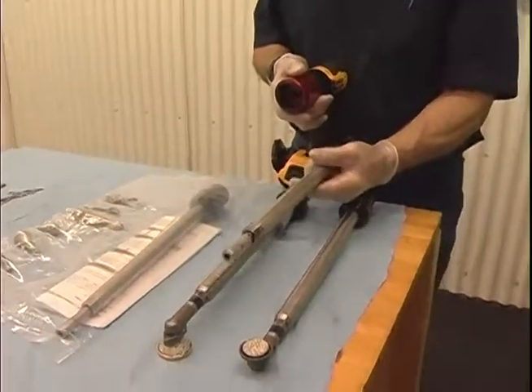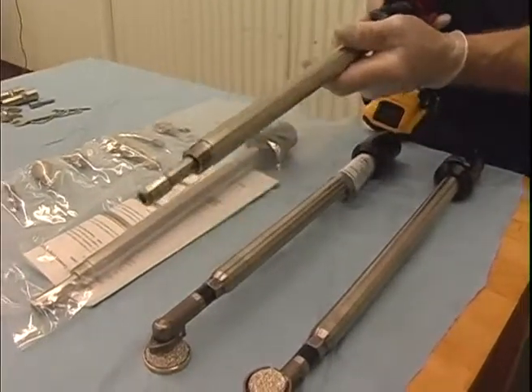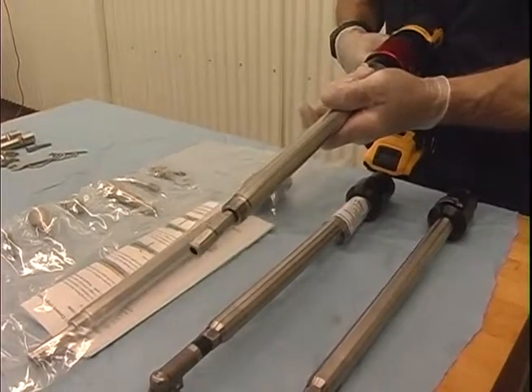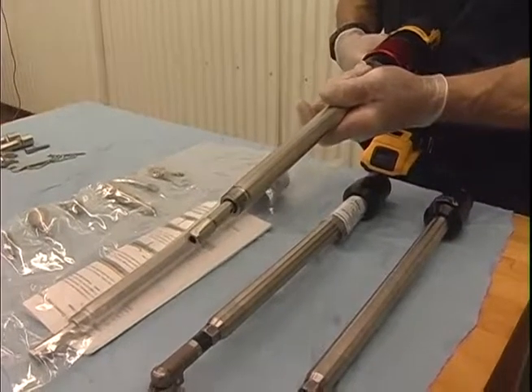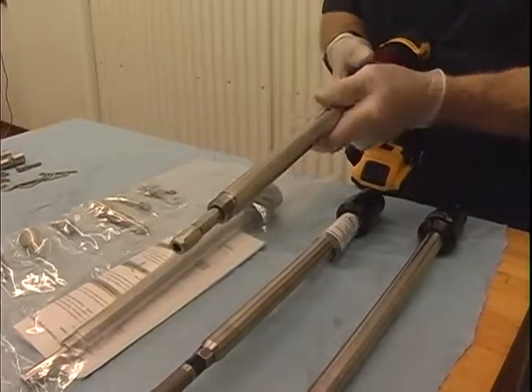This attachment is not a right angle, it's a straight rotary shaft. It clicks on just like the other ones. And on the end of this we can put several different types of burrs depending on what we need to do with this shaft.